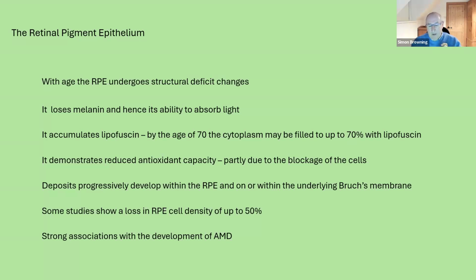So this is our game as optometrists, is to retain the health of the retinal pigment epithelium. And this is where, when I first got involved with autofluorescent imaging, I realized as an optometrist, one of my jobs was to correct vision, and the other main job was to look for health and disease within the eye. But what autofluorescence taught me very quickly was that actually my job was not just about focusing light and looking for disease. It was actually about preserving the eye, preserving the retinal pigment epithelium. Because if that's not working, we don't see.